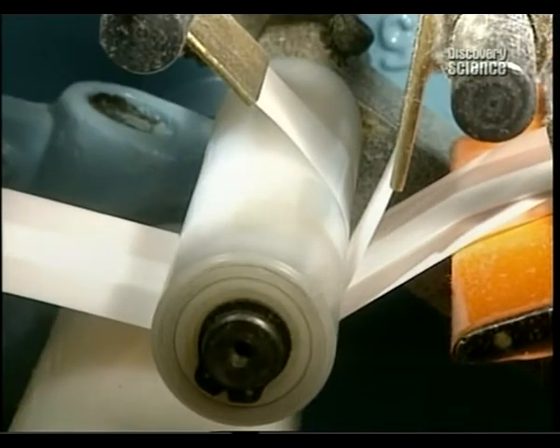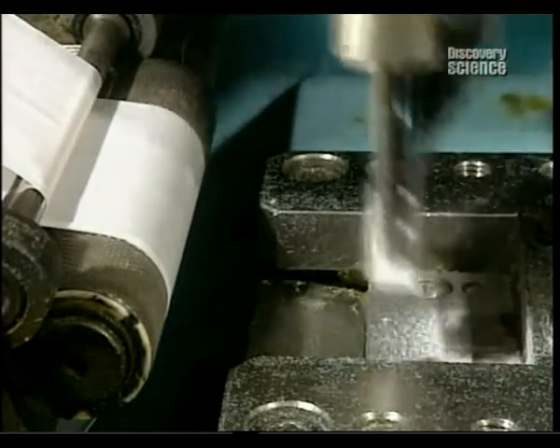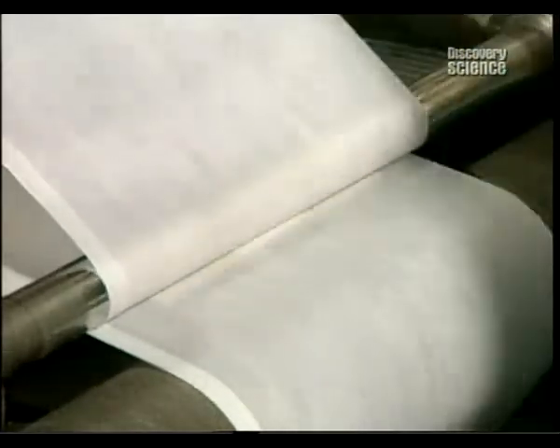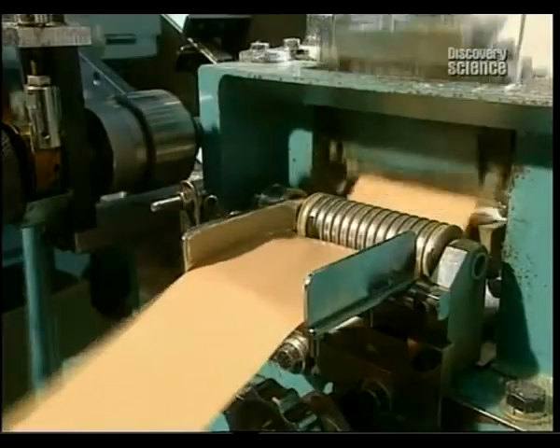The next step is to apply 2 plastic paper protectors over the glue-covered ends of the plaster. Once done, the plaster is drawn by suction with a robotic arm and placed between 2 wrapping papers. In slow motion, we see the wrapping action better. At full speed, it can wrap 300 bandages a minute. The bandages exit the machine perfectly wrapped.